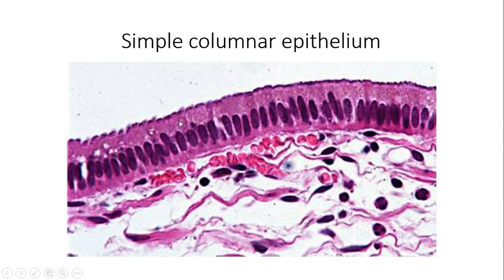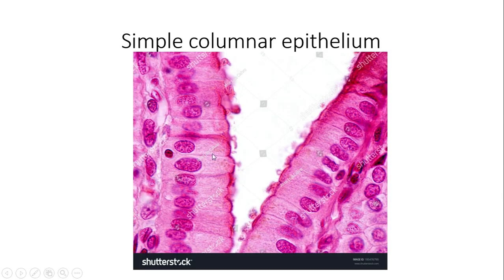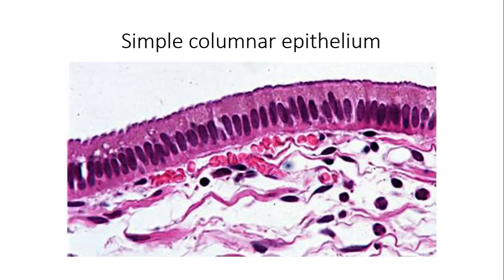And I wanted to show this one because this one is more zoomed out versus these ones. These are a lot more zoomed in, but they might have more zoomed out slides when they're looking at the microscope. So this one is a little bit more zoomed out, but it's the same thing. You can see these very tall-like nuclei, and then how they are uniformly in the same level. All these nuclei lined up very nicely.